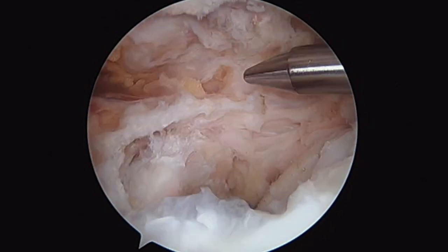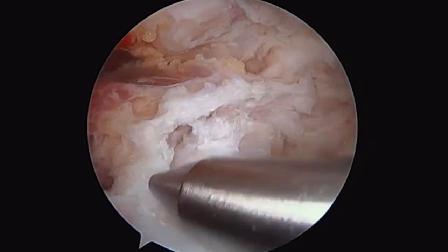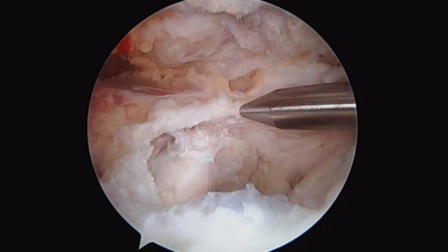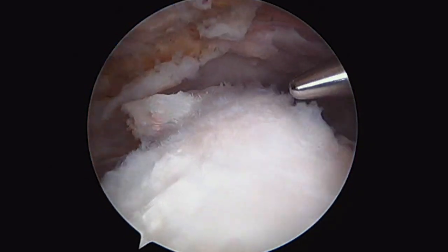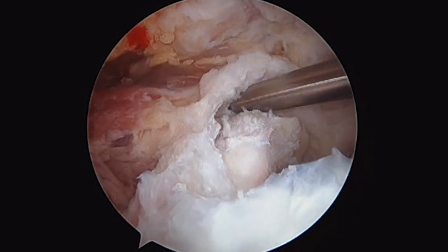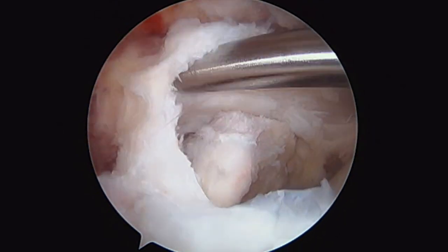This is going to be a tough one. My plan is to bring cuff tissue from the front over to some of this decent looking tissue in the back. I'm going to tie some side-to-side sutures here, and then place an anchor as laterally as I can get it, which is going to be quite medial. Then we're going to bring all of this tissue down after re-approximating it back over onto the humerus to hopefully provide some coverage of the humeral head and allow this rotator cuff to function a little bit normally suppressing the humeral head.